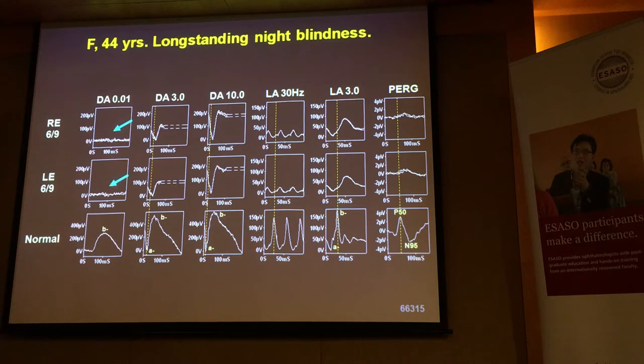The rod-specific ERG is undetectable. Feature one. Feature two is exactly the same wave shape between a dark adapted 3 response and a light adapted 3 response. Don't normally show this, but here it's important because the shape is exactly the same. The A wave is extremely delayed. Here you've got the B wave shown better, but massive delay, simplification of wave shape.